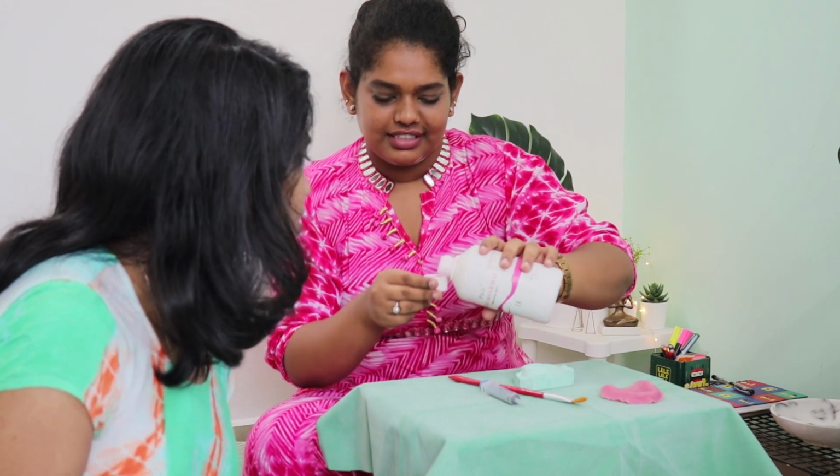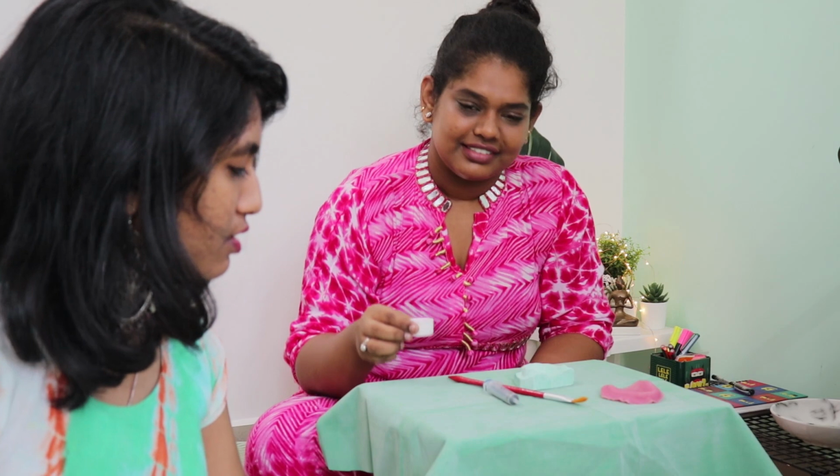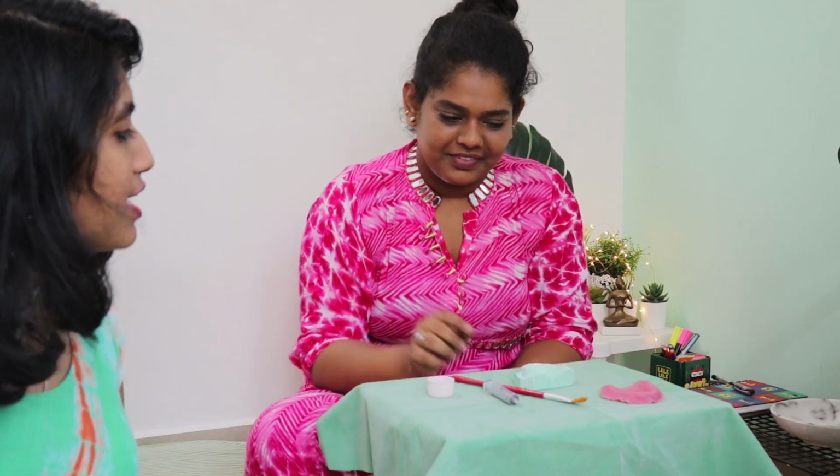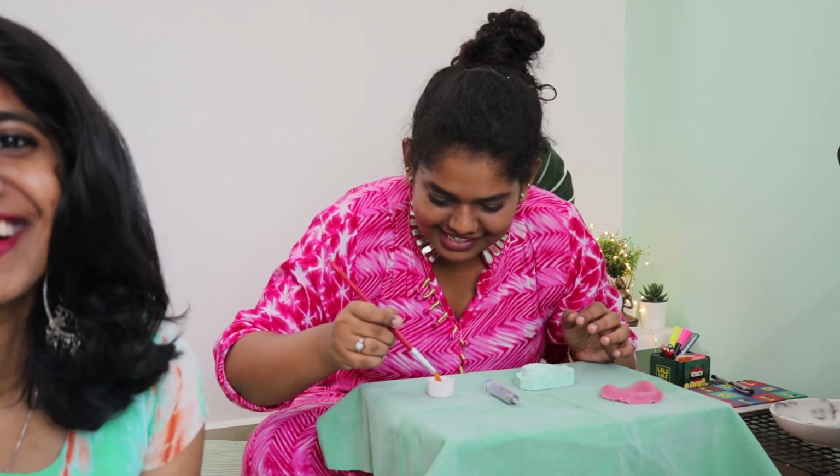போதுமா? ஆ, வேணா ஸ்ட்ரைட் ப்ரோ. ஓ, பட் இது ஓபன் ஆகுமே. தட்ஸ் ஓகே. ஓகே ஓகே, இங்க வச்சிரு. ஓகே ஓகே. சோ we are going to the brush எடுத்து you should paint the entire cast. ஆ, ஓகே ஓகே, சூப்பர் சூப்பர், ஈஸி ஈஸி.